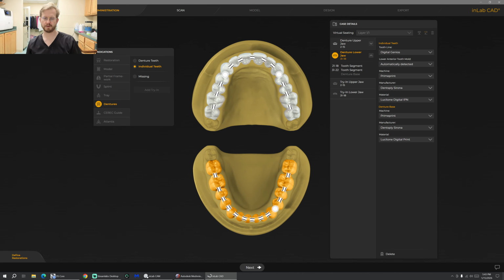I'm curing something in my PPU, my post-processing unit. So if you hear it clicking back there, I'm sorry. The show must go on.